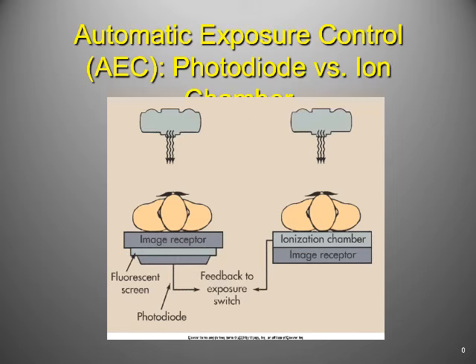What the heck is a diode? Well, the diode's the exact same thing that's in the rectification system. Okay? It's something that only allows power to travel in one direction, right? So as the phosphorescence occurs within this diode, it powers something. It lets it know, okay, that was a hit, that was a hit, that was a hit. We have enough hits. Cut off the X-ray exposure, right?